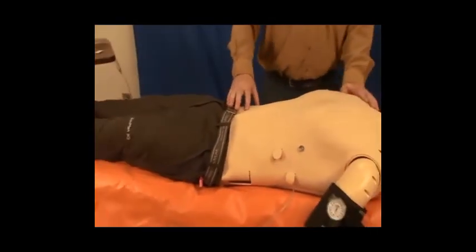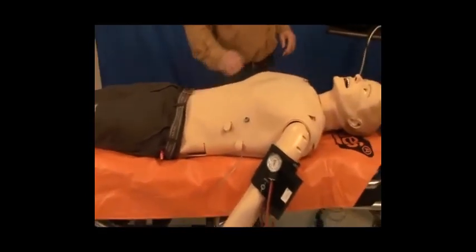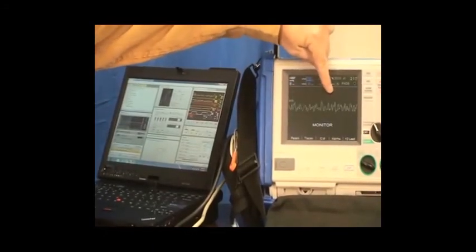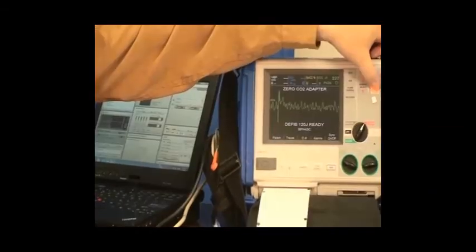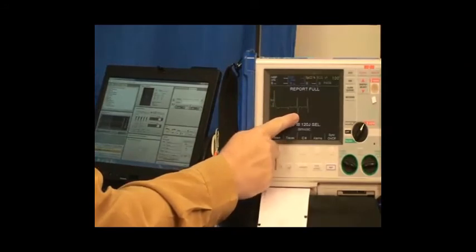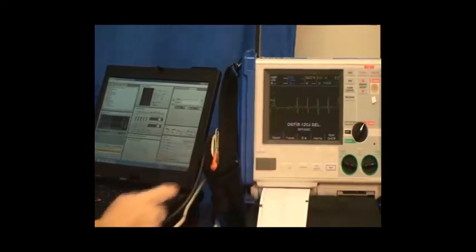Let's take a look at the electrical components of this mannequin. And now you should see here the ventricular arrhythmia. All clear? All right, I'm watching, and we will have a conversion with this particular, I preset this up for a conversion.